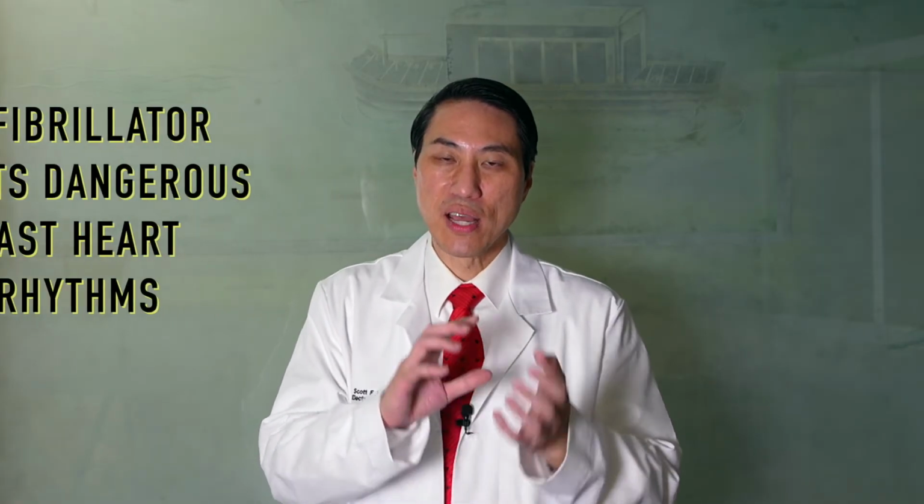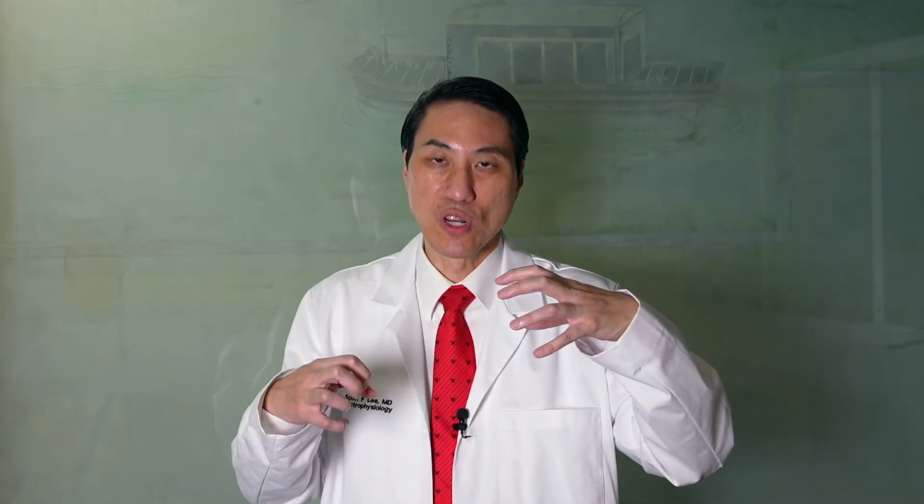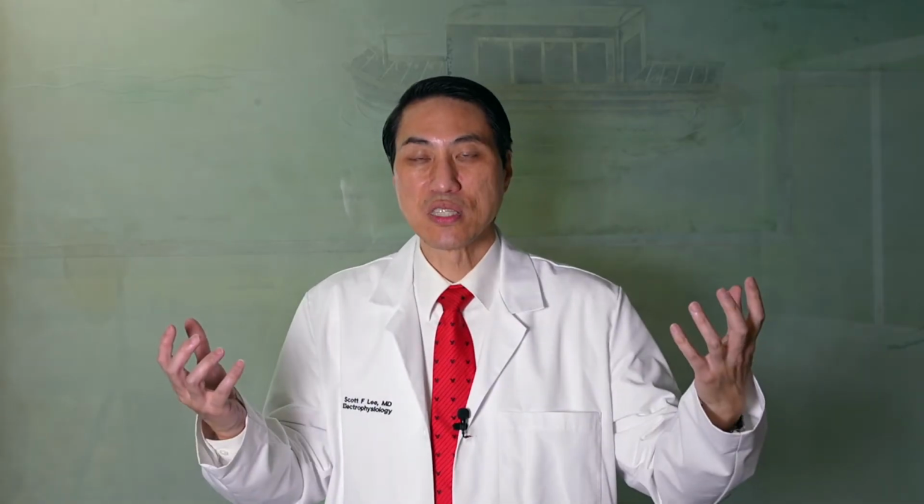So in the same way that pacemakers just treat slow heart rates and would not be any kind of treatment by itself for an abnormal rhythm like atrial fibrillation, because atrial fibrillation makes the heart go fast, and anytime there's two sources of electricity fighting for control of the heart, the faster source always overrides the slower source and takes over control. So that's why if your normal source was going slow at 30 or 40 beats per minute and the pacemaker paces you at 60, well, that's the faster source, and it's going to take over control from the 30 or 40 beats per minute source, and now your heart rate's at 60 beats per minute.